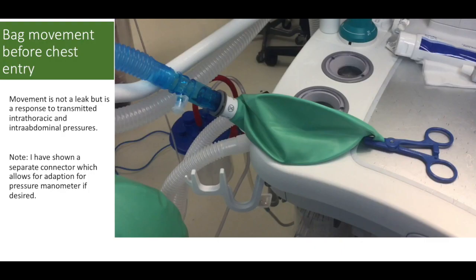Commonly about 4 to 10 minutes prior to the surgeon entering the chest and creating a pneumothorax, the anesthesiologist will stop ventilation to the surgical lung and open that lung to room air or 21% oxygen. In our technique, we don't open to 21% oxygen, but we have 100% oxygen in the tubing. We will see in the following video clip movement of the lung that is associated with, in response to, the movement of the ventilated lung.